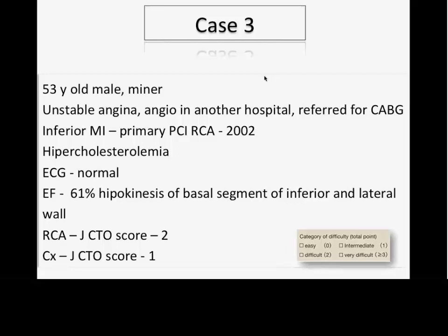For the retrograde, if we go with the opposite side to inject the contrast, or to go from the left to the right, it depends on the morphology. If you have a very huge left main and no disease, I don't use the side holes, so as not to spend too much contrast. But if we have some disease in the left main, some plaque in the proximal LAD, it's better to have side holes, to avoid a problem when the guide wire accidentally goes inside the vessel.